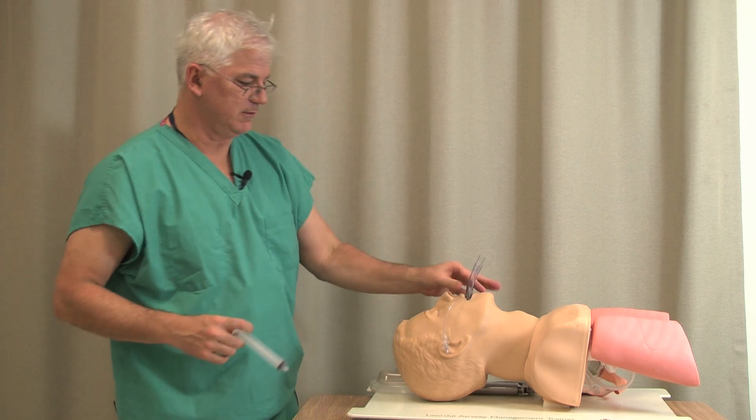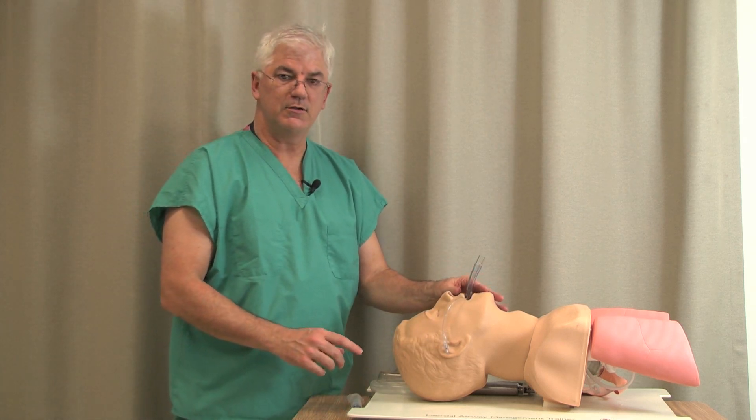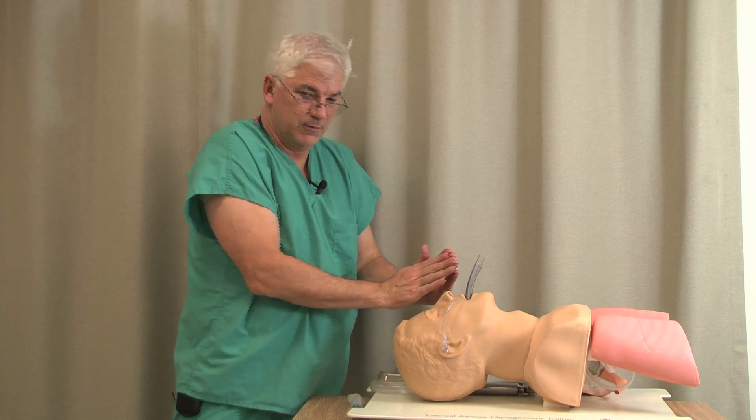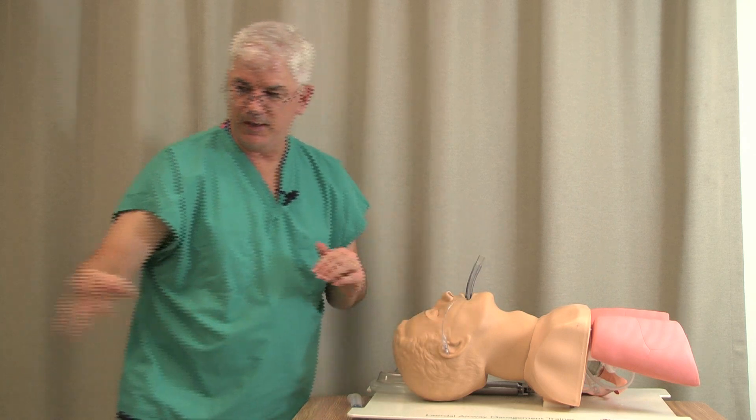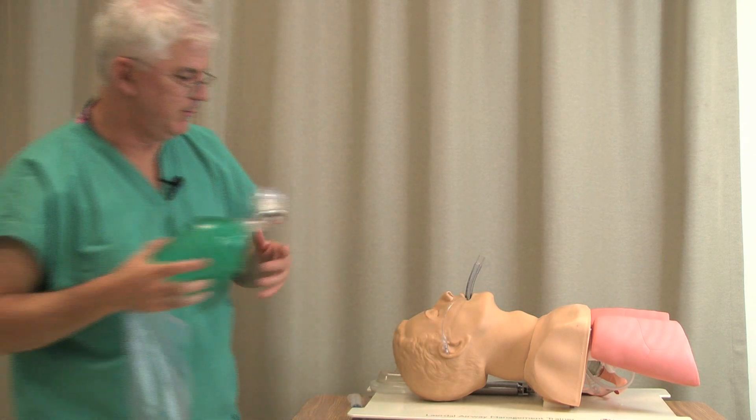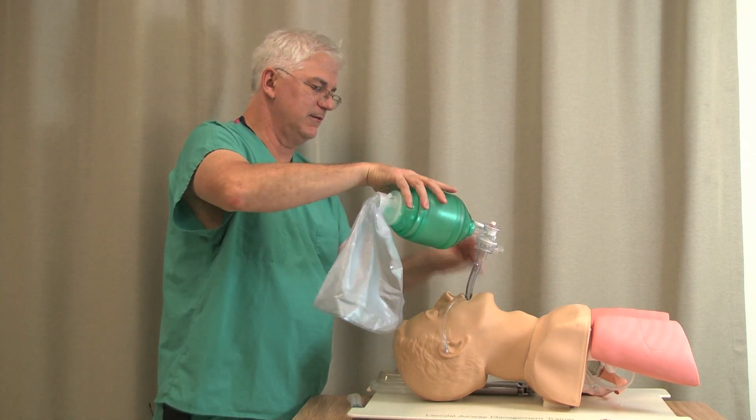Intriguingly, the very person who is hard to intubate because their airway is so tight usually has the LMA fit in there nice and snugly. Once you've put the LMA in, you basically have a way to mask ventilate.